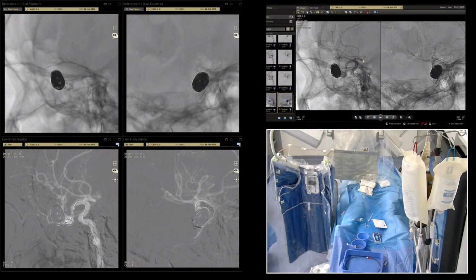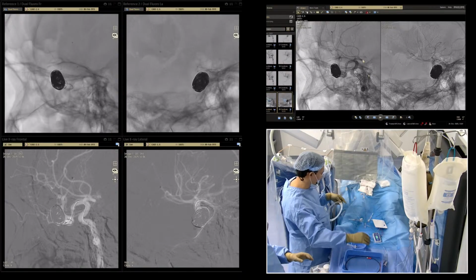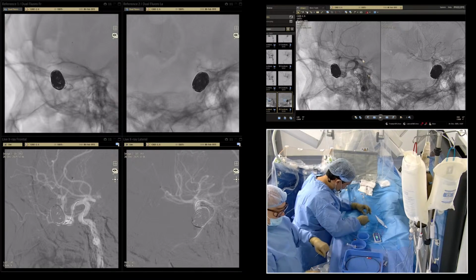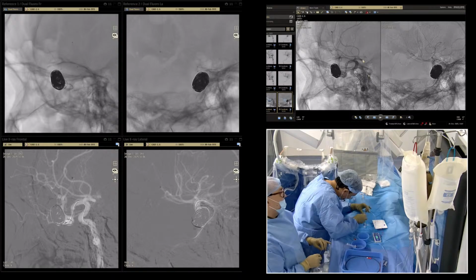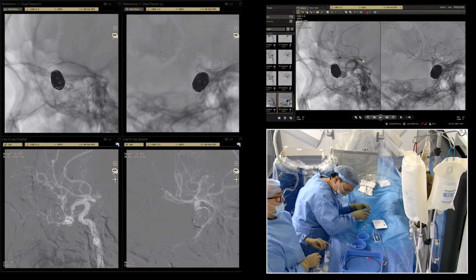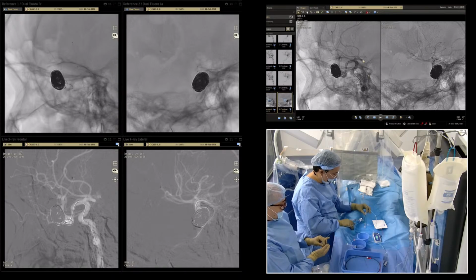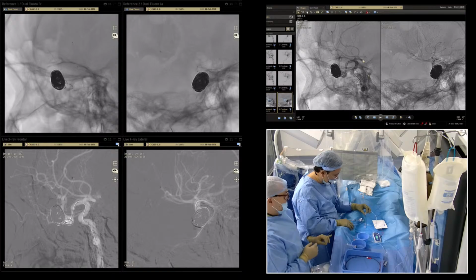It's a laser-cut stent. Why don't I want to choose the Credo? It will not change the flow. There is no ability for flow diversion. That's why I prefer to use LVIS Evo or LVIS Baby, or the number 3 braided stent.